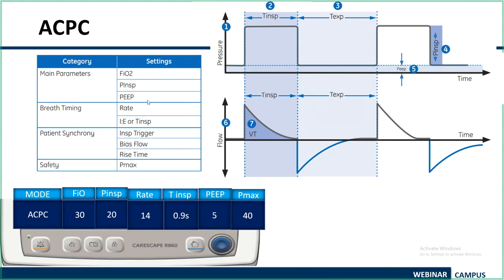And as I've already told, you have to see what is the inspiratory pressure and the other parameters you have set as well. Here you can see the pressure is constant always, but your volume will vary depending on the patient's lung compliance. And here you can see the upper part is always flat. You don't have to do an inspiratory hold maneuver or an inspiratory pause. Whatever pressure control you have kept is above the PEEP.